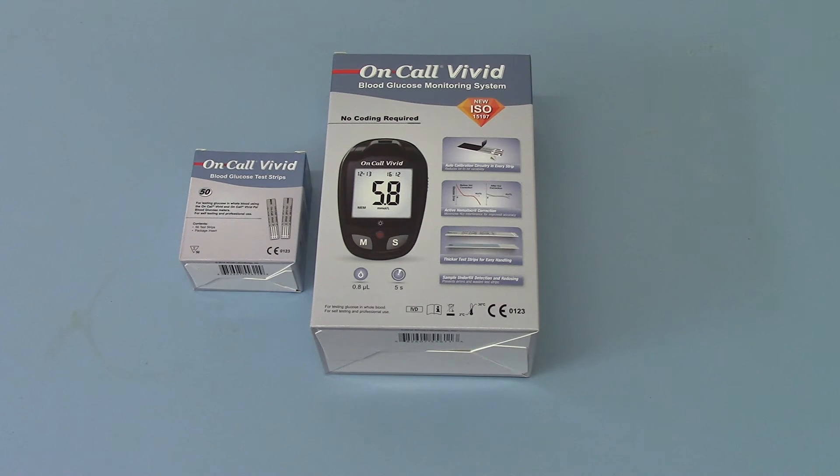The only additional consumables you'd need to run this meter would be periodic purchases of controls and lancets to restock your auto lancing device — we recommend single use of all lancets. Mission does make a range of lancets and lancing devices which are fully compatible with the OnCall Vivid range, coming from the same manufacturer under the Mission OnCall range. So what we'll do now is open this box up and show you the simple operation of the OnCall Vivid blood glucose meter.